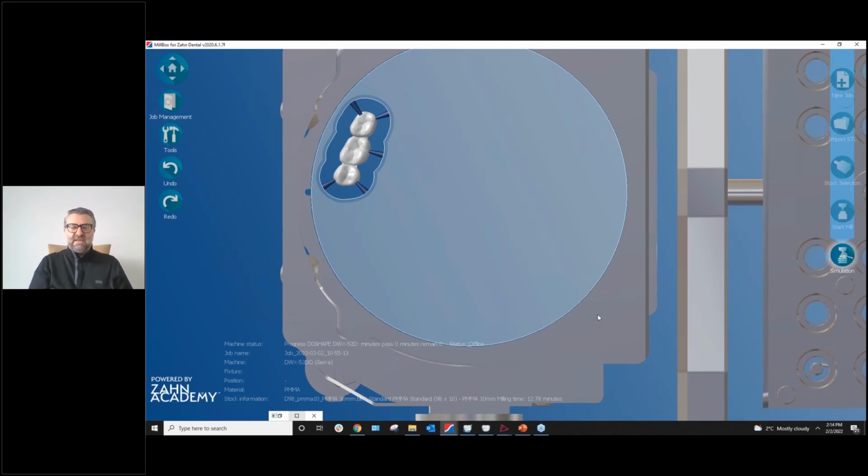But all this to say that within 3 hours, your patient can walk in if you have a clinical practice, let's say a denturist practice, you can actually produce that model, whether it's from an intraoral scan or a conventional alginate impression, pour it and then process it like the steps that I showed you today.